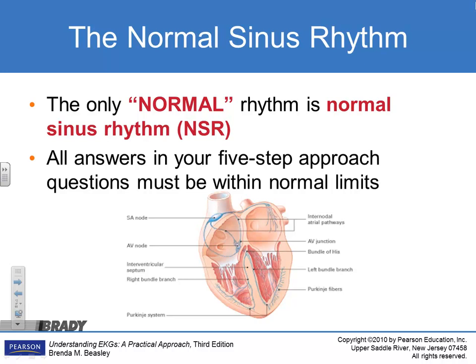What about the QRS? We've got two parts of the QRS. They're what? To be a sinus rhythm. Yeah, it's got to be less or equal to 0.12. They have to be present and they have to be uniform, regular, so to speak. That makes a normal sinus rhythm.